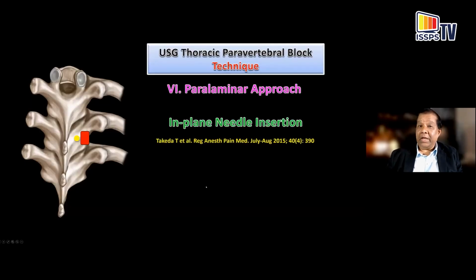Otherwise, no major complication. Dr. Takeda from Japan, again, Japan seems to have a good history of paravertebral block. You can see from Shimane, it went down south to Dr. Shibata, and now to Dr. Takeda. I think he's from Sapporo. Anyway, it's an in-plane needle insertion with a medial injection technique using a low frequency.